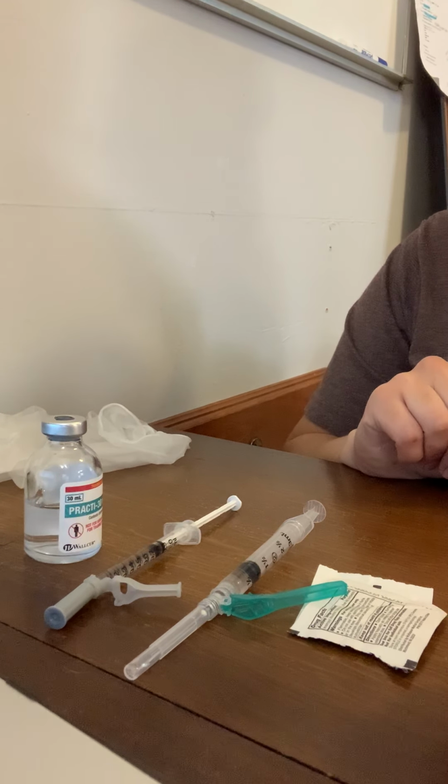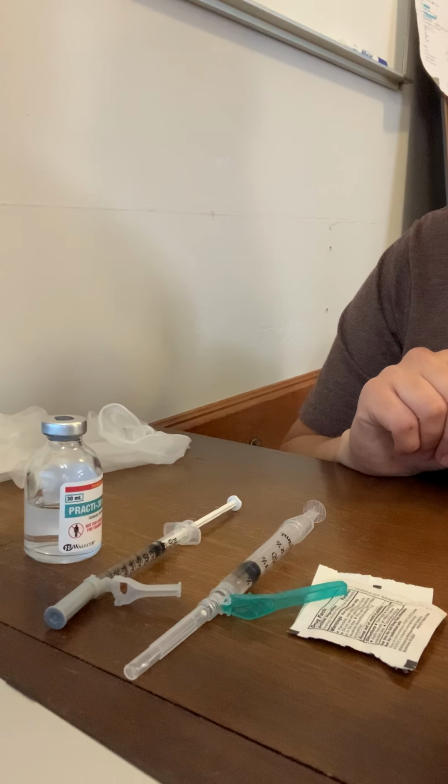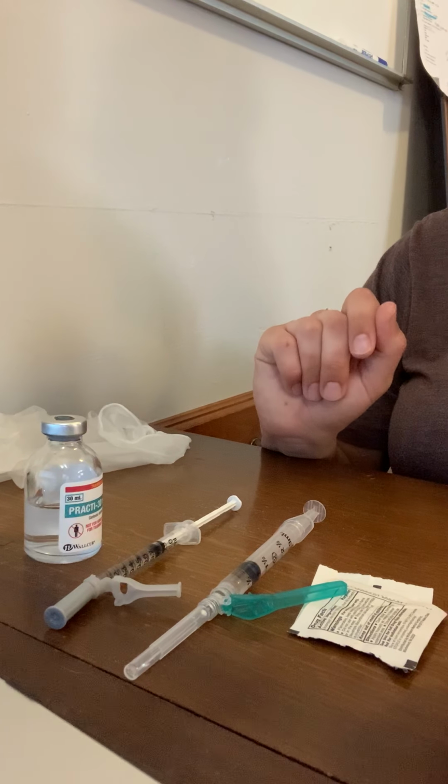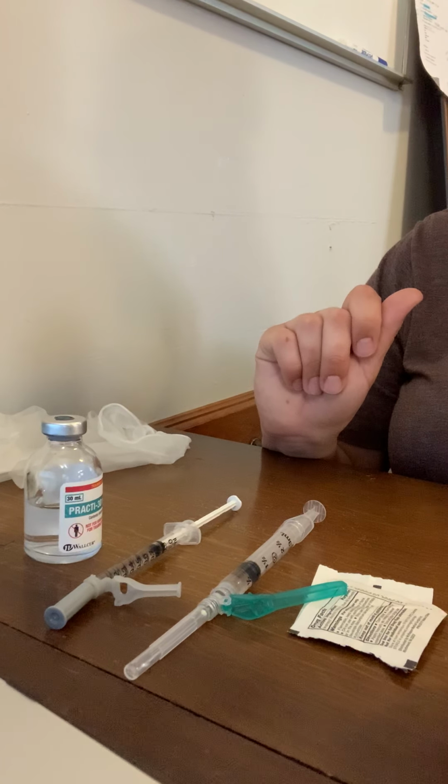Another site is the vastus lateralis. It's on the lateral thigh, 4 fingers below the greater trochanter, 4 fingers above the patella, and I will inject into the middle third of the lateral side of the thigh.